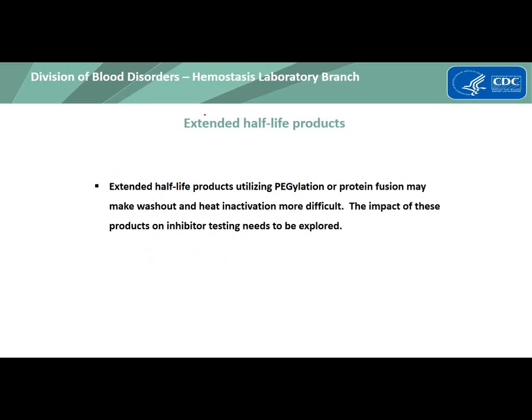And then I will mention as it relates to extended half-life products that using pegylation or protein fusion products may make washout and heat inactivation more difficult, and so therefore the impact of these products on inhibitor testing needs to be explored. And studies asking these questions are currently underway in our laboratory.